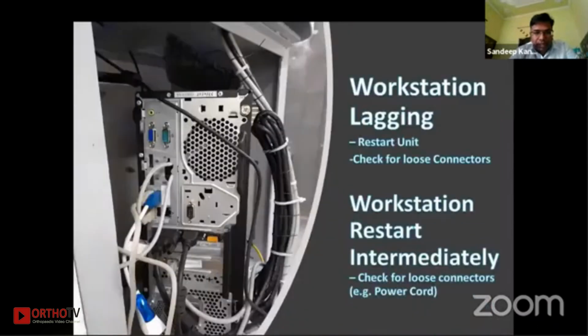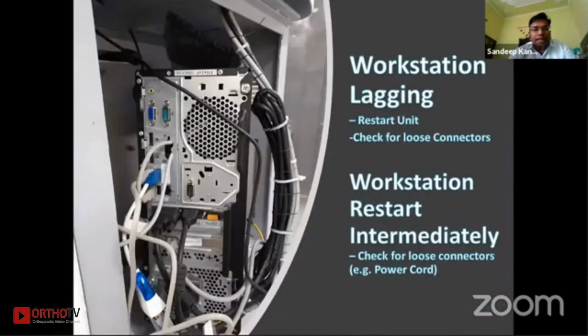Next, sir, is workstation lagging. Sometimes it restarts. Sometimes the unit hangs, in layman's language. So we restart the unit or check whether any connection is loose. One problem we face majorly is that sometimes the workstation restarts intermittently.